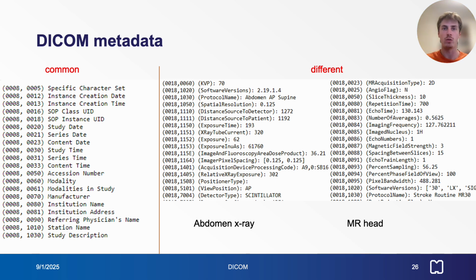DICOM's information model ensures consistency across images in the same study or procedure by replicating shared data into each image instance, creating self-contained composite instances for seamless identification and interpretation, even when images are separated from the originating system.